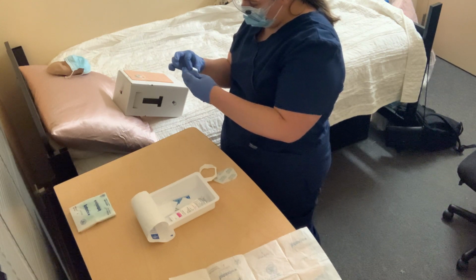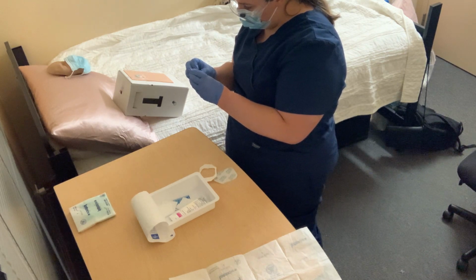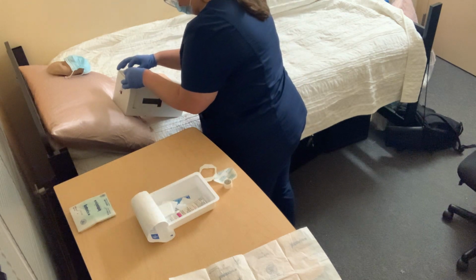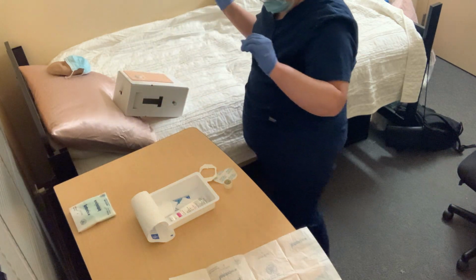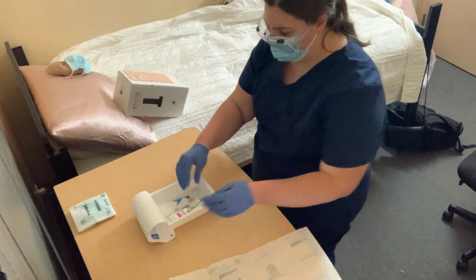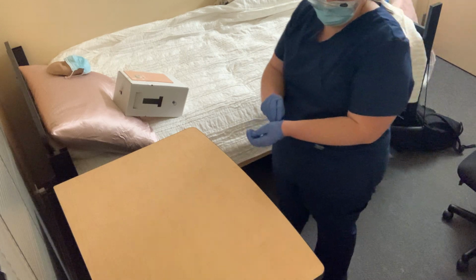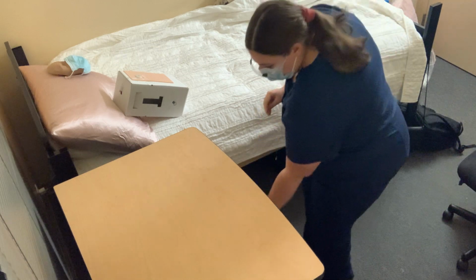I'm going to use the tape to secure the tubing on the patient's chest. Just to make sure that that tubing doesn't move around and bother the patient. And now I'm going to clean up my site. Getting rid of the materials that I did not use. I'm going to take off my gloves, do hand hygiene.